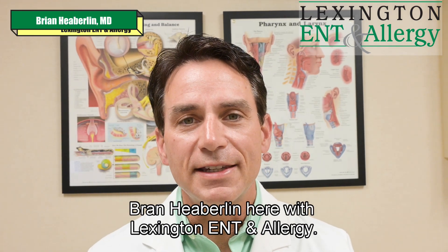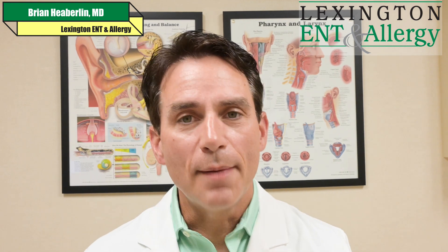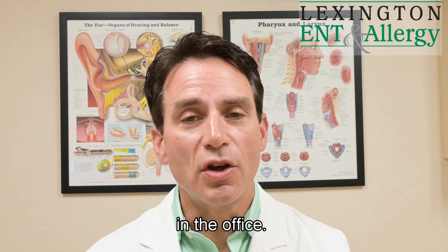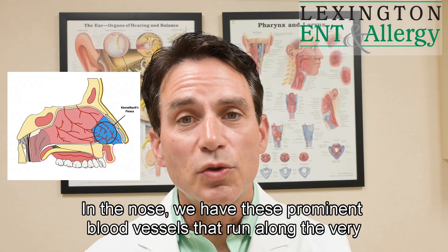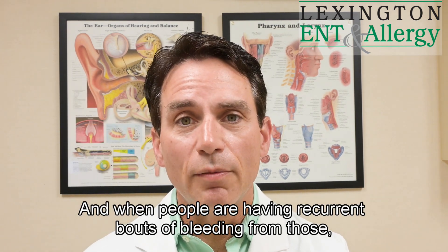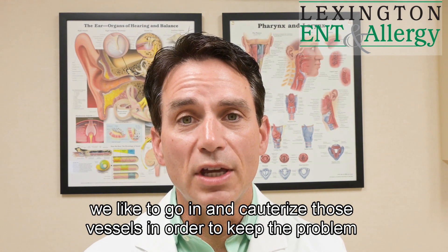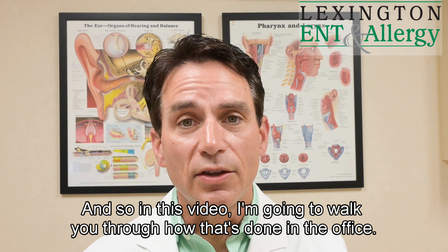Dr. Brian Heverland here with Lexington ENT and Allergy. I've done several videos about nosebleeds or epistaxis. In this video I'm going to walk you through how we cauterize someone's nose in the office. It's really a pretty simple and not that uncomfortable procedure in most circumstances. In the nose we have these prominent blood vessels that run along the very front surface of the septum, and when people are having recurrent bouts of bleeding from those we like to go in and cauterize those vessels in order to keep the problem from recurring.